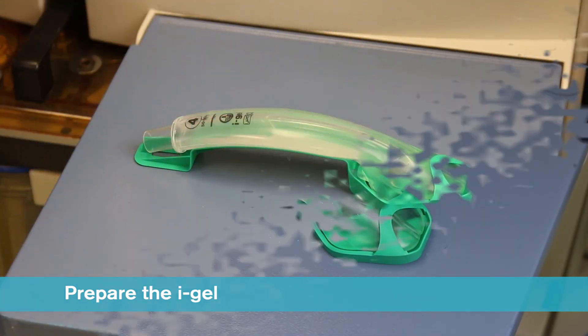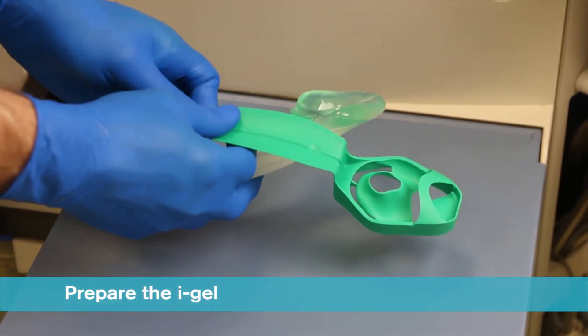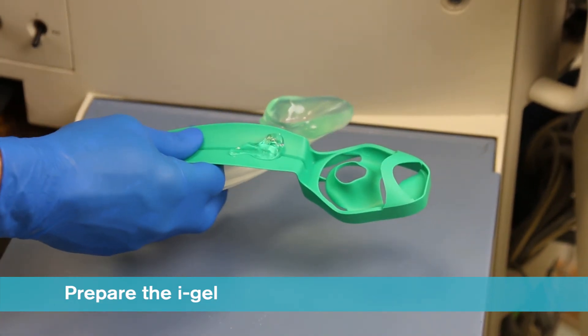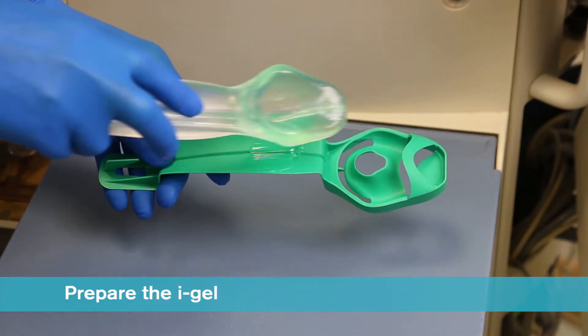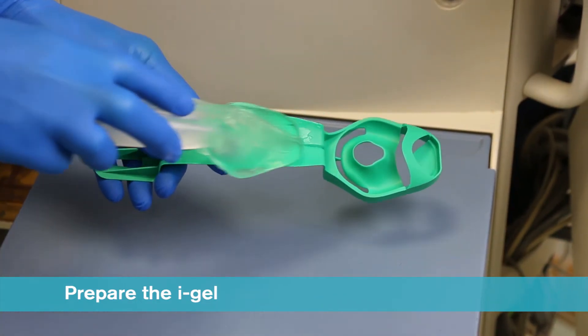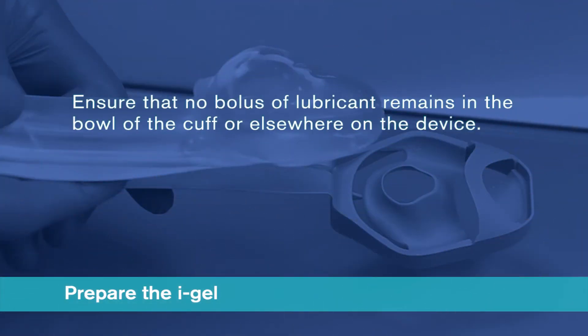In the final minute of pre-oxygenation, remove the iGel and place a small bolus of a water-based lubricant such as KY Jelly onto the middle of the smooth surface of the cradle or cage pack in preparation for lubrication. Do not use silicon-based lubricants. Grasp the iGel with the opposite free hand along the integral bite block and lubricate the back, sides and front of the cuff with a thin layer of lubricant. This process may be repeated if lubrication is not adequate. After lubrication has been completed, check that no bolus of lubricant remains in the bowl of the cuff or elsewhere on the device.